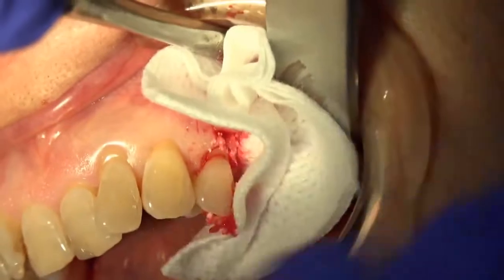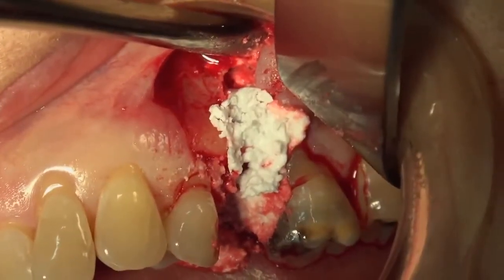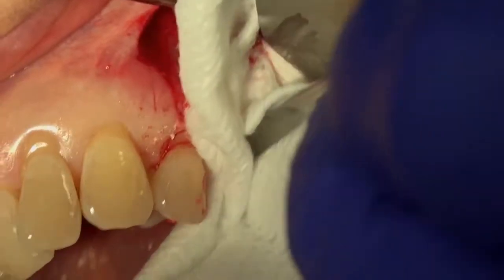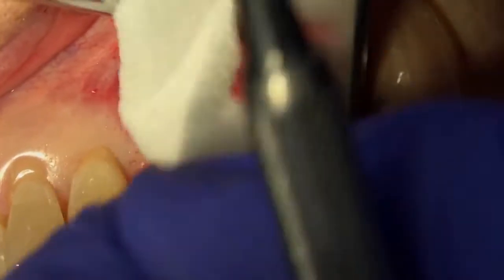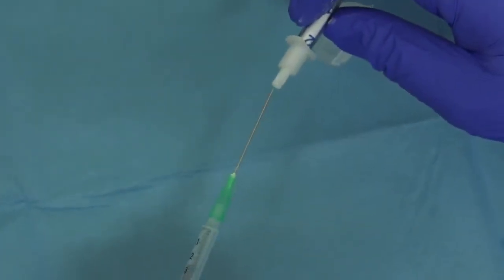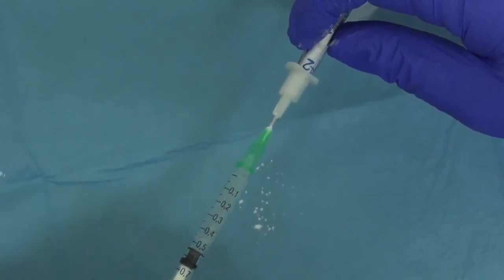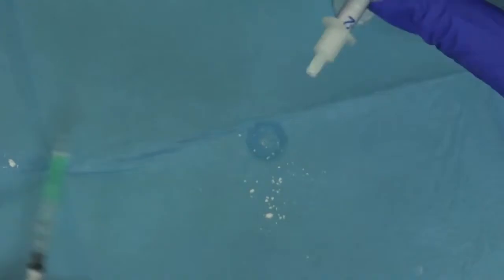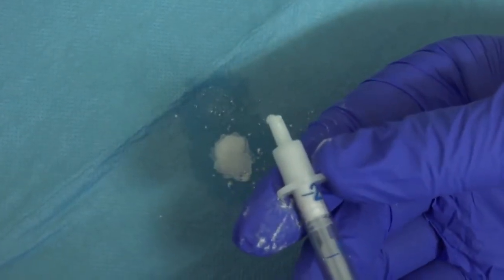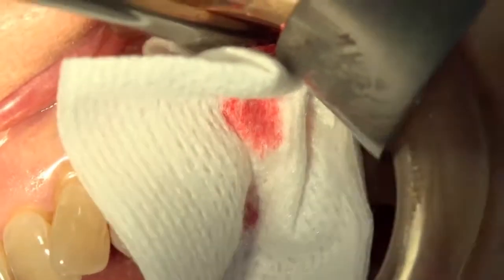Now we take a dry gauze, and here, because there is no place for our finger, we use the spatula in order to compact the cement. We add another layer, again pressing for 3 seconds, not more than this. Now, since we used half a cc, in this case we need a little bit more, so we can use another syringe. Remove the small cap, insert all the way down the needle, start ejecting the liquid until a small drop is coming out. Then, holding the wings, start pushing the piston to expel the liquid surplus until we feel complete resistance. Then eject it again into the site and press firmly for 3 seconds.